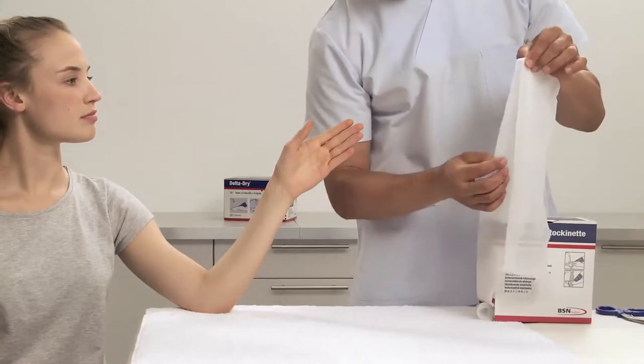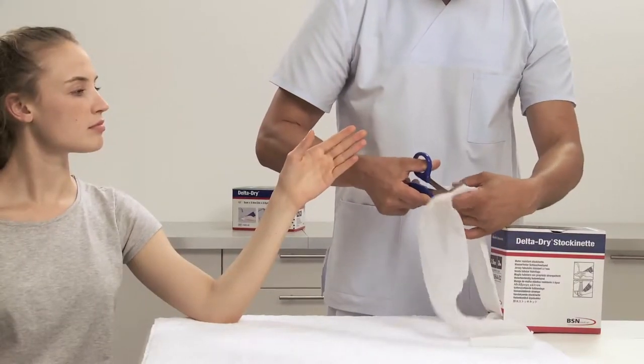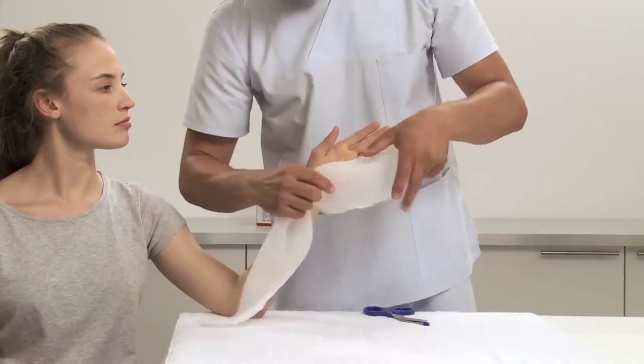Choose the appropriate width of Delta Dry Stockinette that will fit snugly but does not constrict the patient's arm. Measure the length from elbow to fingers, add 50% of that length, and cut it.